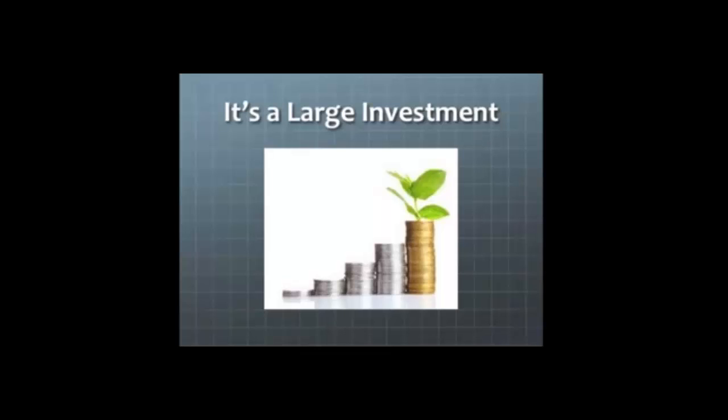The cost of purchasing and installing a PACS system depends on the size and software needs of each organization. PACS is a major investment for any healthcare organization. Proper PACS selection requires ample time, personnel, and research. Some of the factors that should be considered prior to purchasing a PACS solution include financial resources and IT infrastructure, including the capabilities of your organization's IT department, implementation work plan, and contractual terms, including warranty, maintenance and support, interoperability, and data security.